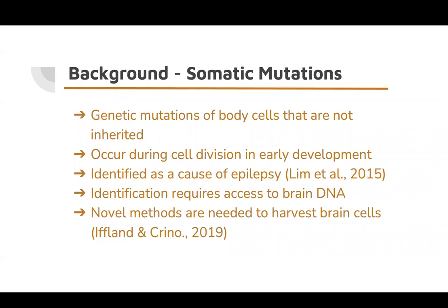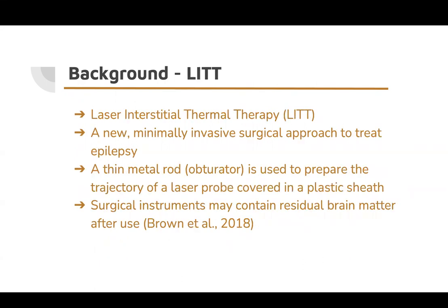This brings us to laser interstitial thermal therapy, or LITT for short. LITT is a new and minimally invasive surgical approach to treat epilepsy that has been increasing in use. The procedure involves the use of a thin metal rod called an obturator to prepare the trajectory of a laser probe covered in a plastic sheath. Due to the nature of the surgery, no tissue is harvested or extracted. However, the surgical instruments may contain residual brain matter after use.